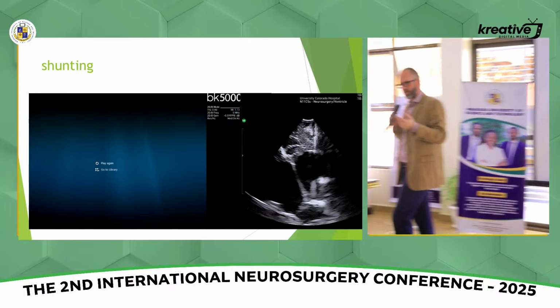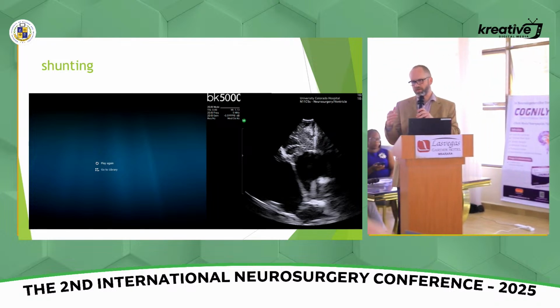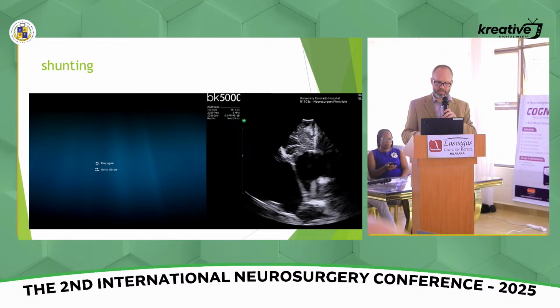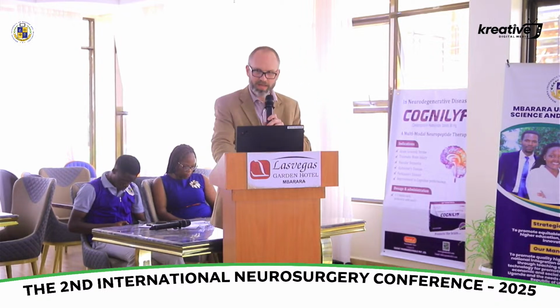Although the metal artifact you could see very well with the stylet when it went in, this just is meant to show you that if you have a small probe, like a burr hole probe, you can easily access the ventricles, but at surgery, if you have hydrocephalus because you've obstructed and you have a lot of brain herniation, this can help nicely guide you in to drain the ventricle, especially if you're in a non-anatomic position.